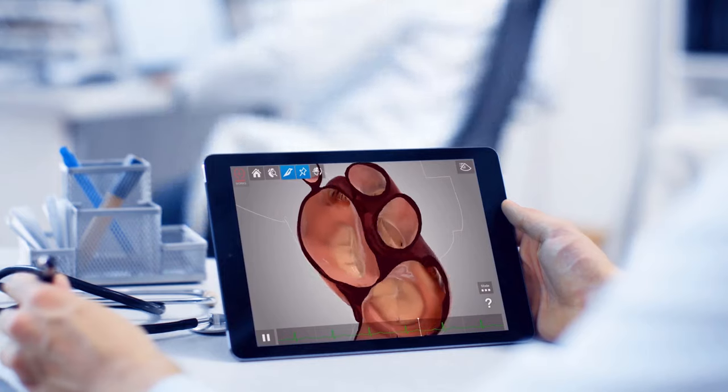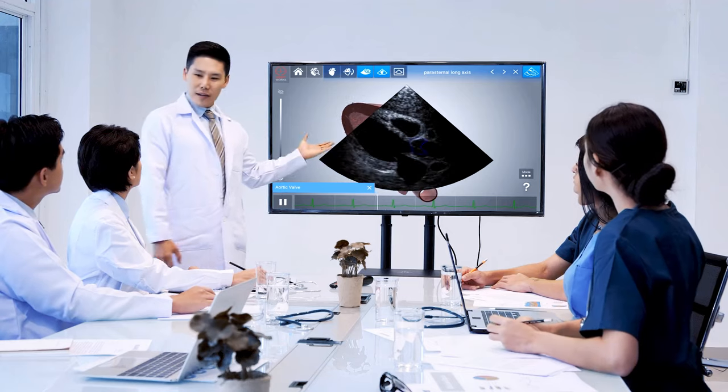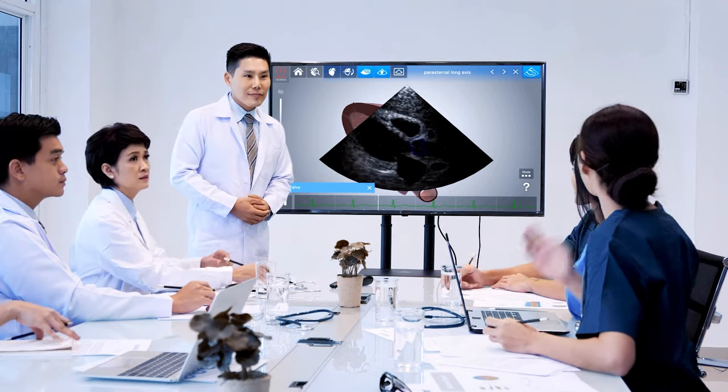HeartWorks AR enables self-directed learning, and teaching can take place one-on-one, in small groups, or in lecture theatres where the display can be connected to a large screen or projector. But HeartWorks AR is not just an engaging learning tool — it can be used to facilitate discussions between clinicians and is an excellent way to demonstrate cardiac anatomy to patients.